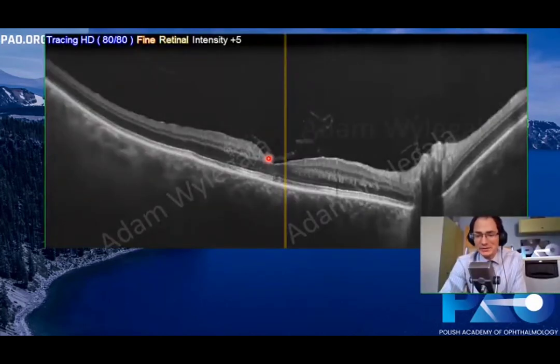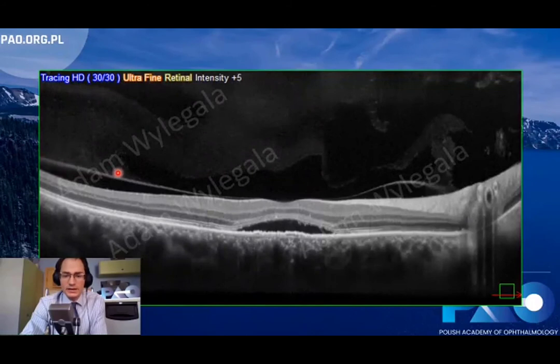Can we see floaters in the OCT? Sure. If we have a good enough system, we can see floaters in the bursa premacularis, naturally floating here. We can see them in the vitreous chamber. There is a slight, very subtle epiretinal membrane, but also we can see the floaters here. Another example is the PVD, an incomplete PVD. It's naturally not the largest problem that the patient has, but this can also cause some form of visual disturbances. But look here, deeper inside the eye, we can also see some sort of floaters in the vitreous.